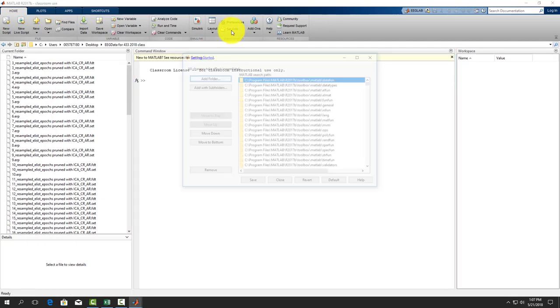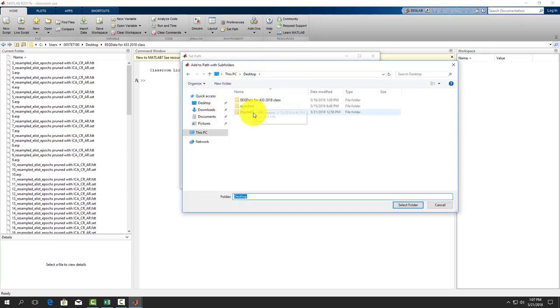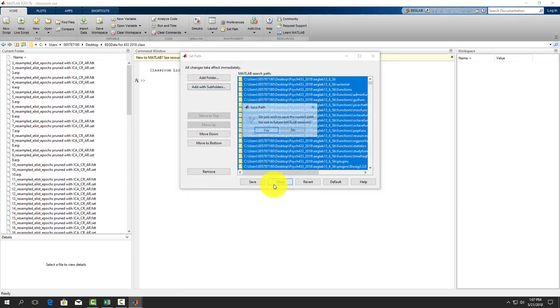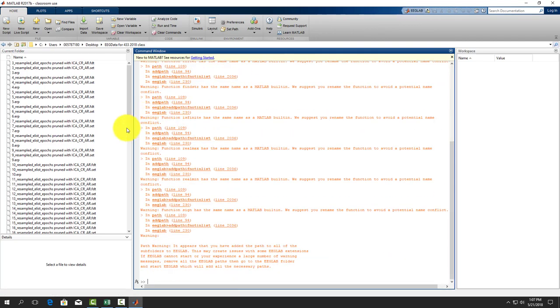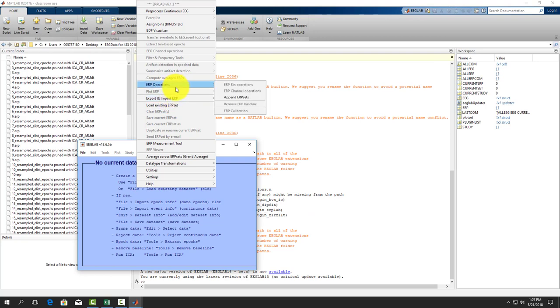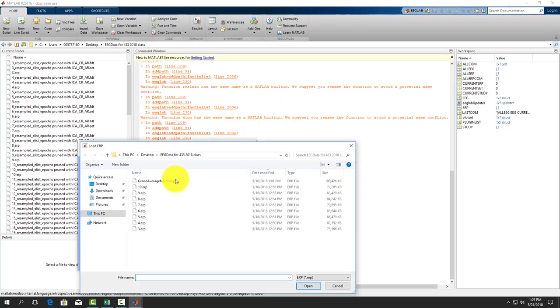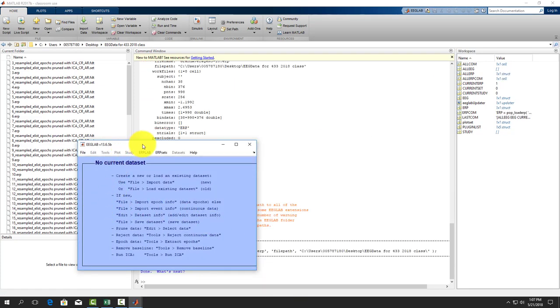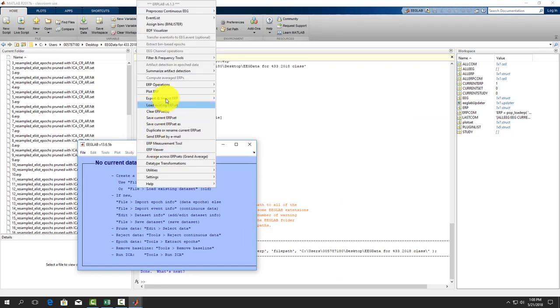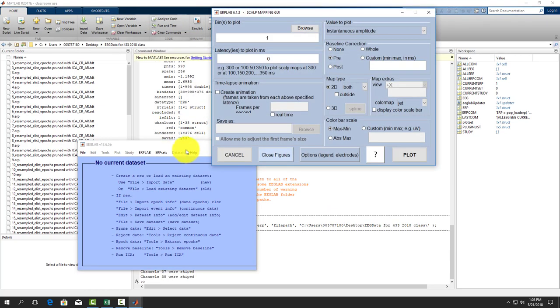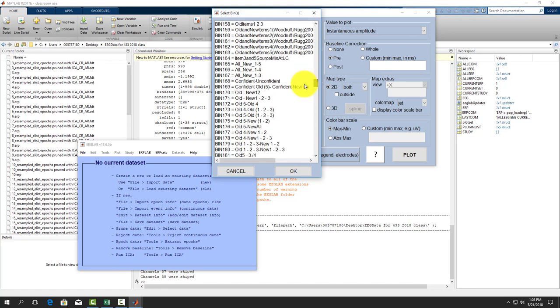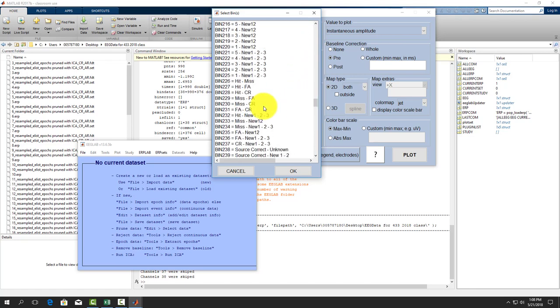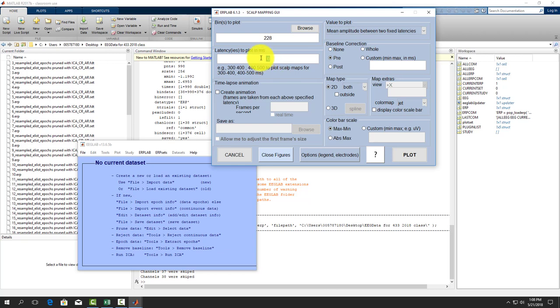We're loading in existing ERP set, taking a grand average one that we made before. Now we want to plot our scalp maps. I'm going to do it pretty simply this time for just a two-dimensional map. We want to change our value to plot to mean amplitude between two fixed latencies. Our latencies in this case was 700 and 900. We're going to display the color scale map.